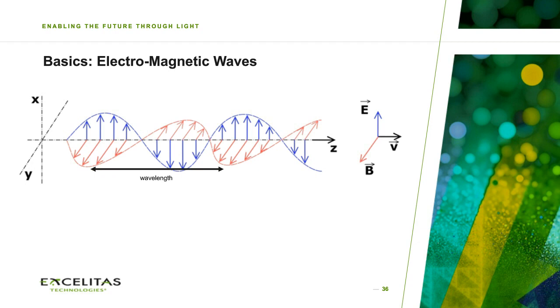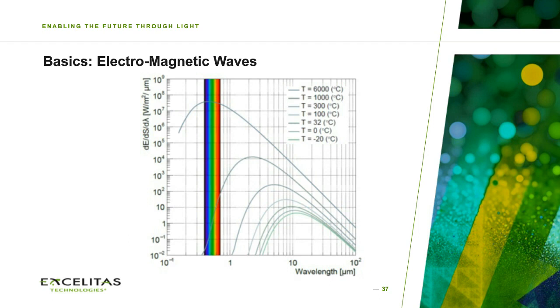And the basics are, you're looking at electromagnetic waves. The electromagnetic waves, which are emitted from the surface, have a wavelength. And having a look at the wavelength, you can see a nice plot here. I would like to take you through this one because it's quite an important one, despite it seeming very crowded and difficult to understand. This wavelength, so the length of the maxima or minima of the electric or magnetic component, you can see on the x-axis. It's on the bottom.